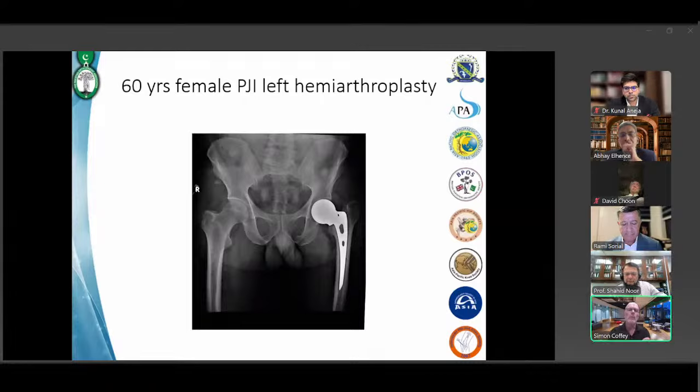Okay, great. And was the implant functioning well before the infection, or was there pain? Because if there was pain before the development of infection, I'm suspicious of loosening, but I'm not guaranteeing that there is loosening, and that's relevant because it can be difficult to remove these stems if they're not loose. Yeah. So she had symptoms prior to the onset of infection, and we can see on the X-ray there's no calcar. She's short. Yeah, that's right.